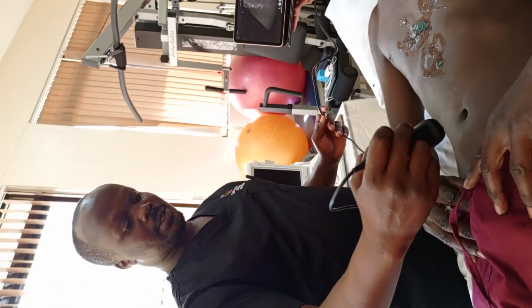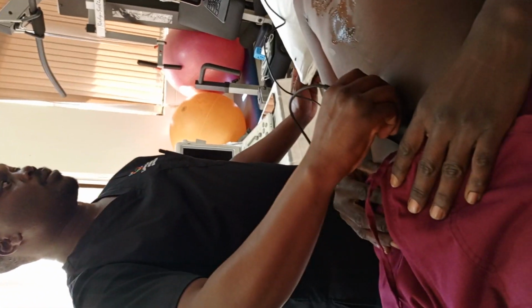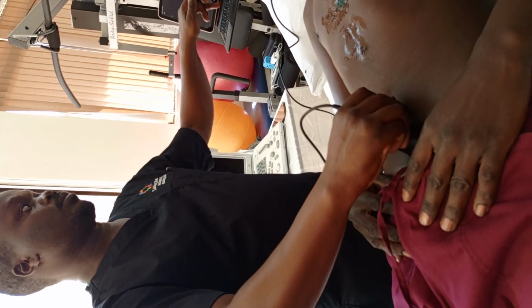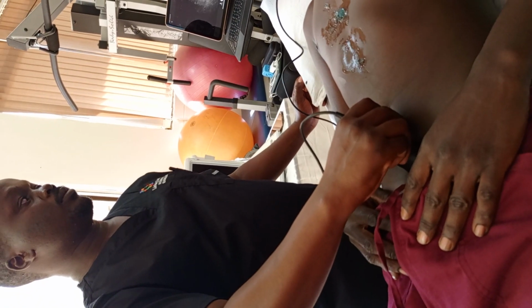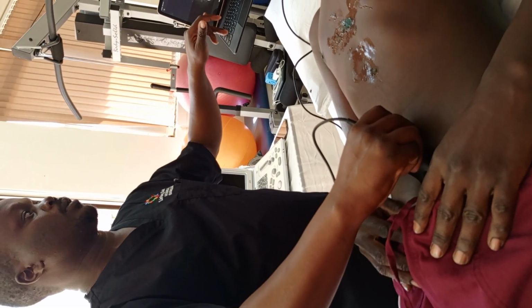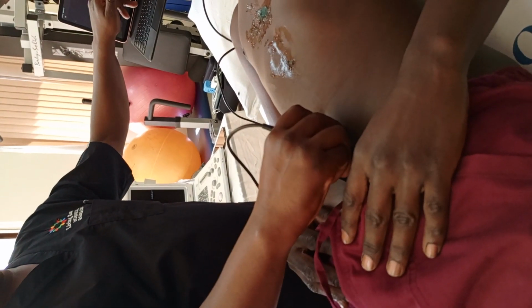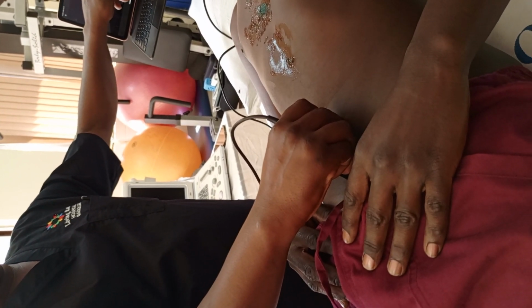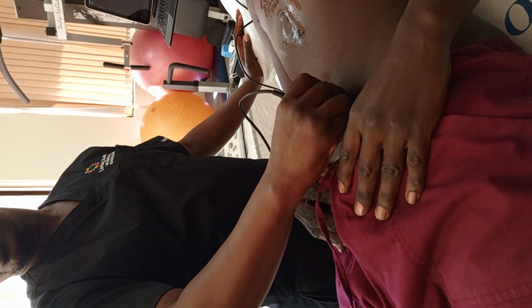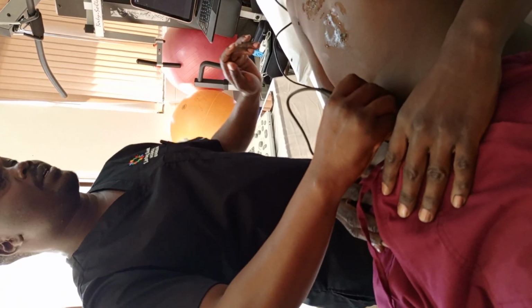We're going to look for the bladder and make sure that there's no free fluid outside the bladder. Remember, so this is bladder, and I see black. And I just told you, when we see black, it's fluid, and we have to be worried. Except, he has a bladder right there. We know his bladder has urine in it. We're looking for any black outside of this wall of the bladder. This black is not the same as that of fluid. I have to see the difference. Is this dark region here? It's not okay. That is the rectum. Yeah. So you are trying to find free fluid around that.